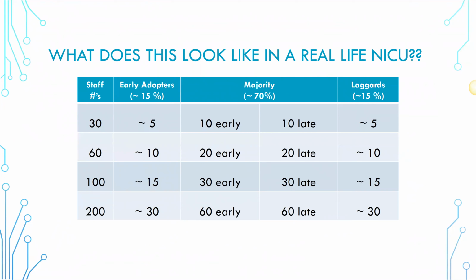So certainly HIE and cooling, those babies, mild babies definitely should be monitored, even if you are not a cooling center that does mild babies. Many places are doing mild babies, but that's another discussion. Anytime, of course, you're cooling, any baby that's at risk for seizures, stroke babies, abstinence babies, metabolic syndromes, heart, ECMO, any kid. I actually monitored a kid once, post-arrest, just to kind of see how their brain looked.